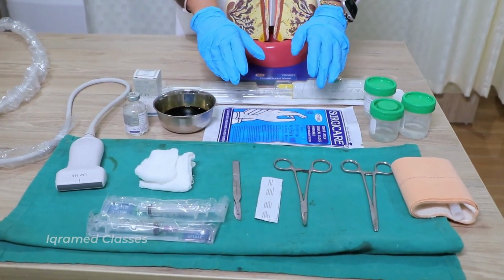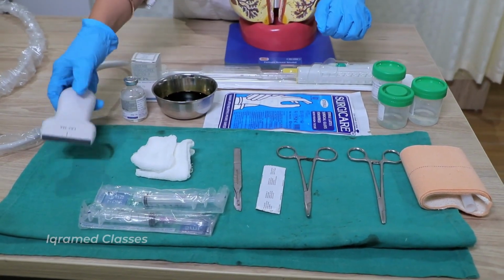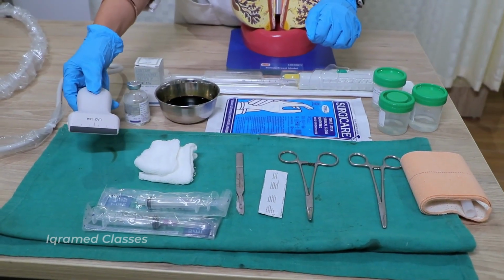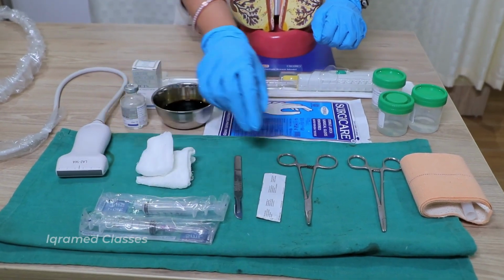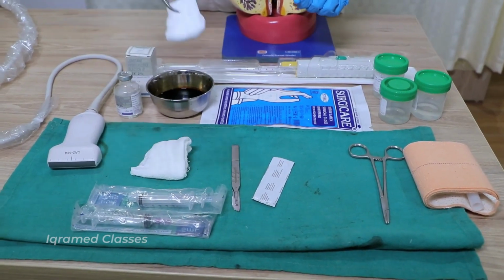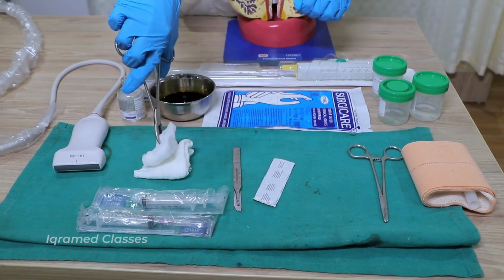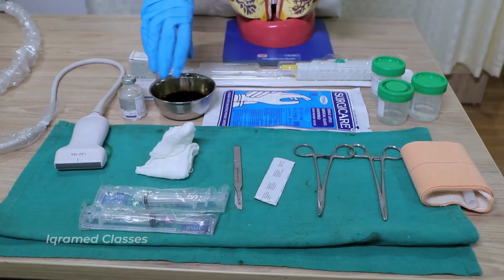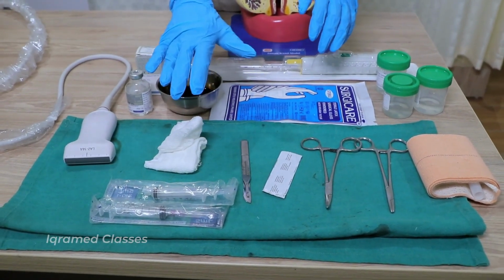For the fine needle aspiration cytology, first and foremost what you need is your linear ultrasound probe, because you will localize the lesion with this. You need betadine solution, you need gauze pieces. You will dip a gauze piece in this, clean the probe with it, then you are going to hold the second gauze piece, clean the patient with betadine, throw the gauze piece, keep the rest handy.